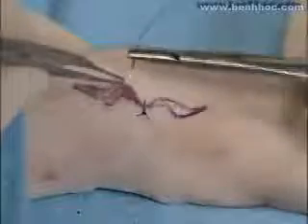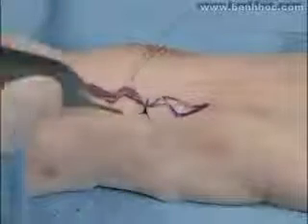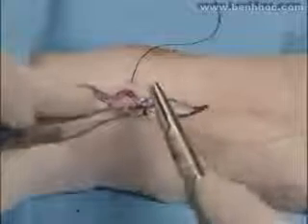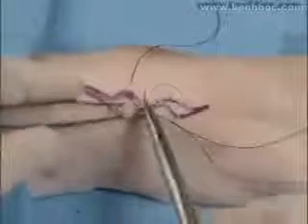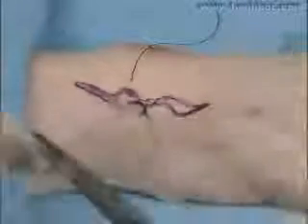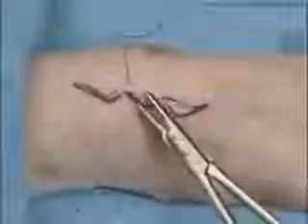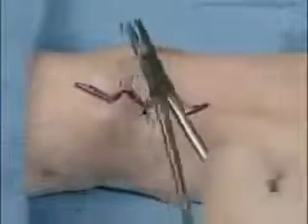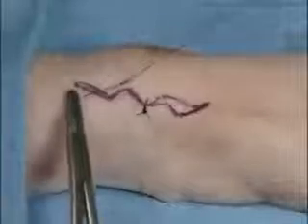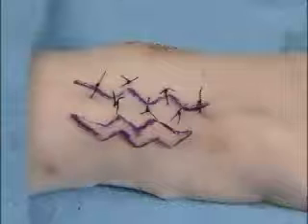Here the sutures are interrupted, again from a valley to a peak or from a peak to a valley at the apex. Corner stitches may be used. Here's an example of a corner stitch being used at this site into the dermis to prevent tip necrosis. They are not necessary in every case. And now the second throw is through the skin, and the suture is then tied down to close the wound. Instrument tie certainly may be used, or a hand tie may be used. Always use square knots.